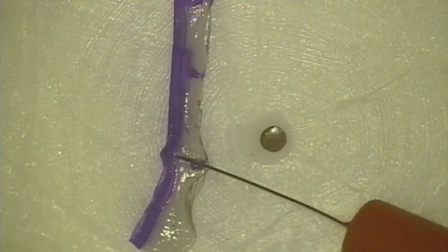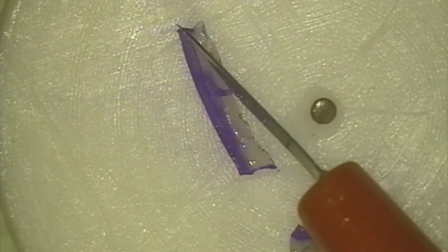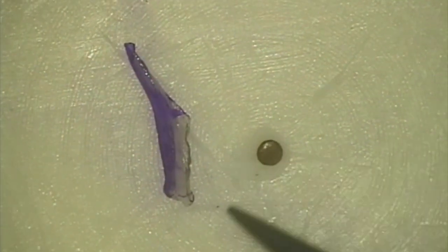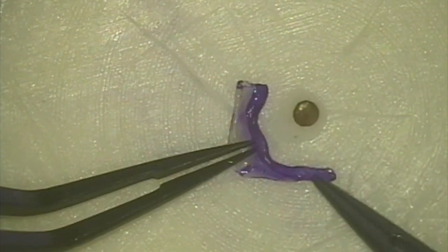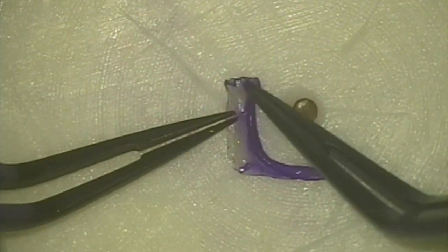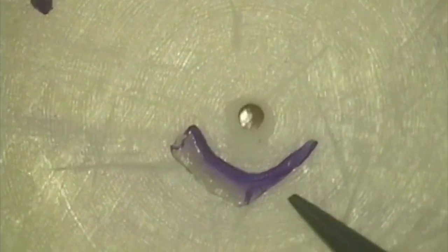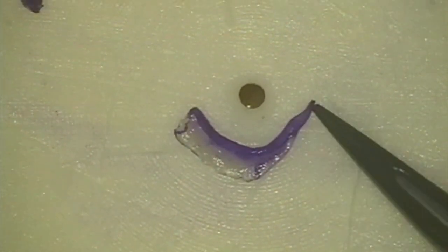The first mark is cut and the second mark is also cut, giving us the total length of the segment. Between the second and the last mark I also create a tapered segment. So this segment is full thickness in one part and tapered in the other, and this is used for tailoring the CARES segment specifically to the individual patient's topography, thereby obtaining a better and more customized result for each patient.